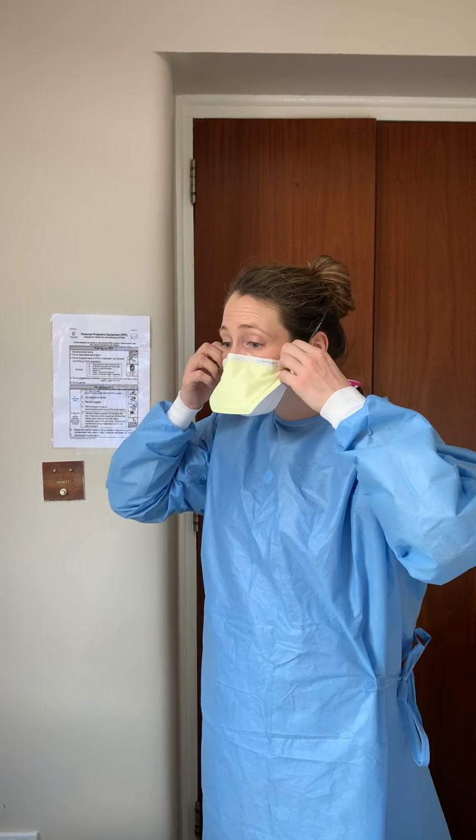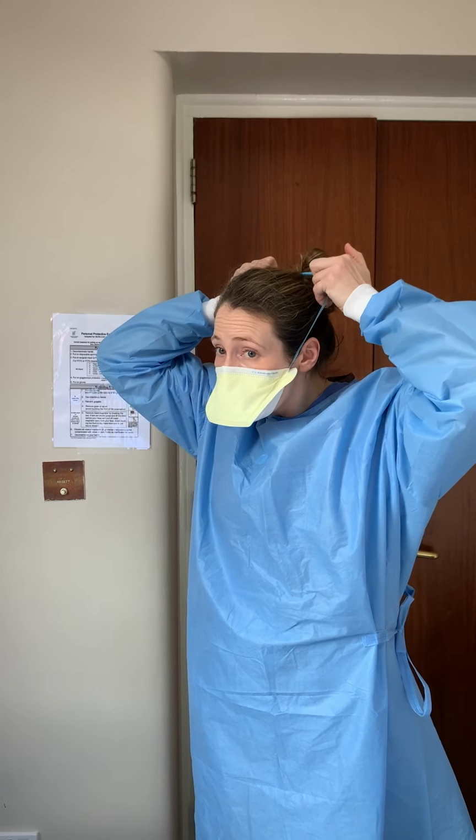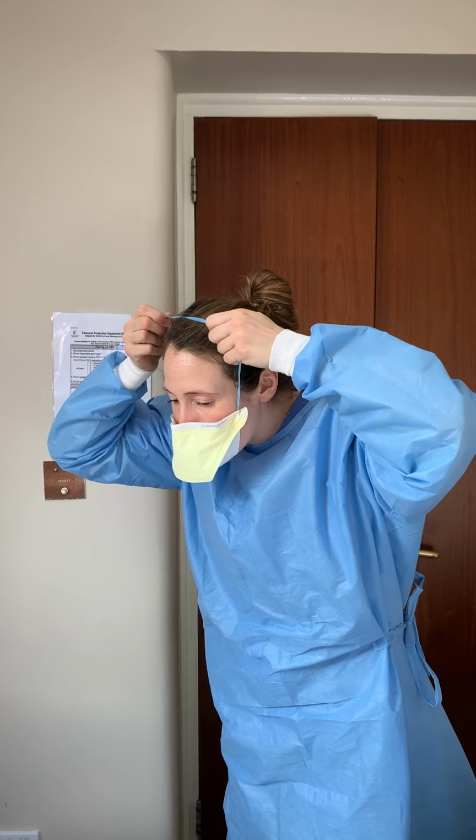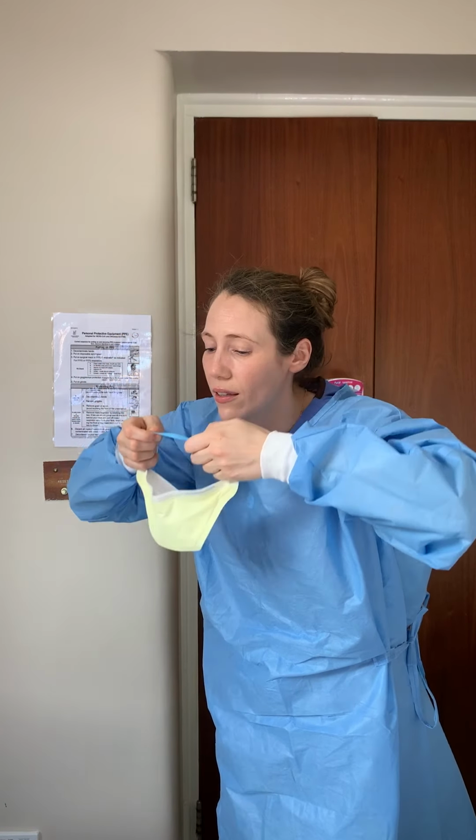Once you've finished your patient contact, you doff your PPE in the same fashion that you would normally, except when it comes to removing your mask outside the patient's room or outside the red zone, you'll do so in the following way. Holding on to the bands across the head, you can lift them gently up and away from your face, and then leaning forward, allow the mask to fall away from your face, immediately disposing of it in the healthcare waste.